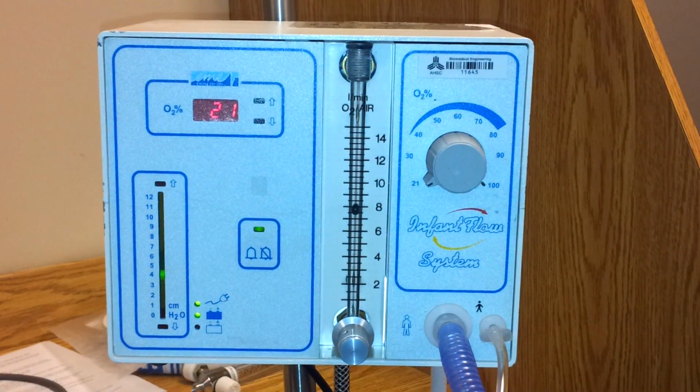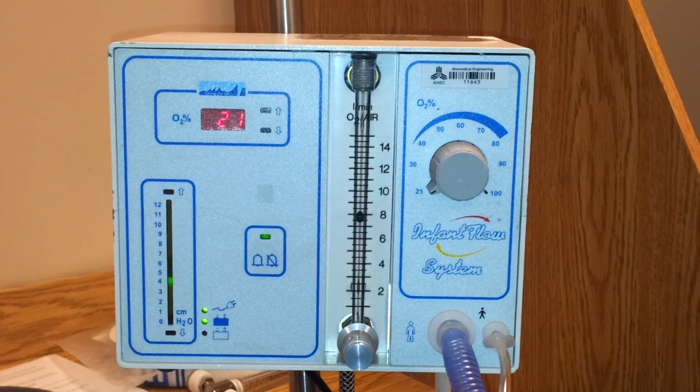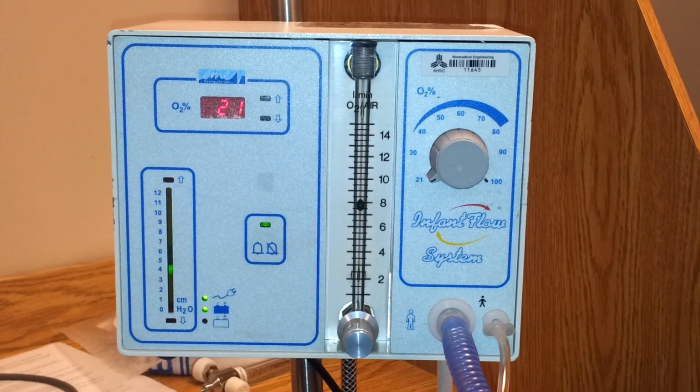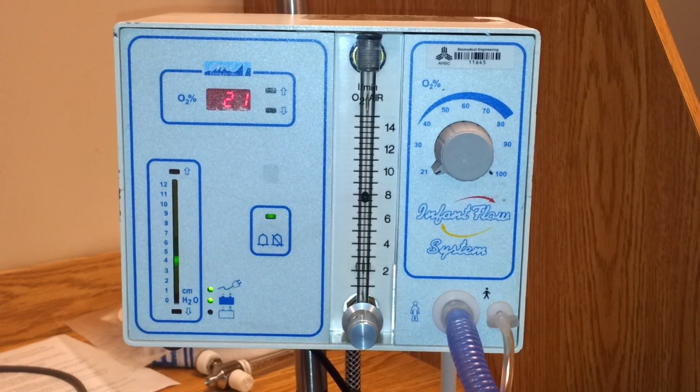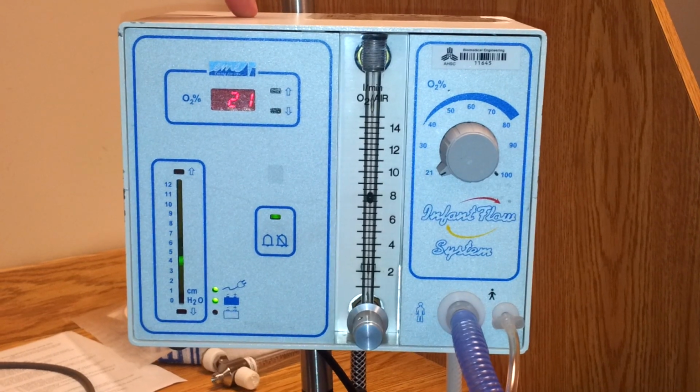Okay, we're going to be going over the nasal CPAP CBO today. Basically everything you have to know and what's expected of you to pass the CBO with the instructors or RT. So we're going to go over the machine first, just show you all the basic buttons on it.